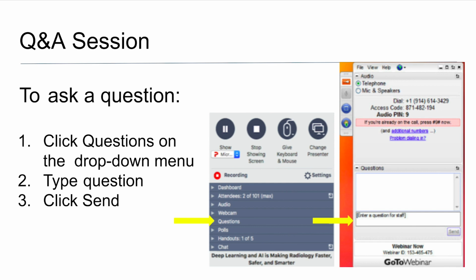But there are definitely a lot of motions, especially for patient cases. If the PET scan is very long, 20 or 30 minutes, some patients cannot hold still in the scanner, so there might be motion. That definitely introduces some difficulties for this type of multi-modal registration algorithm. But on the other side, if we can work at low count, or enable faster scans, we can also reduce some potential motion issues.